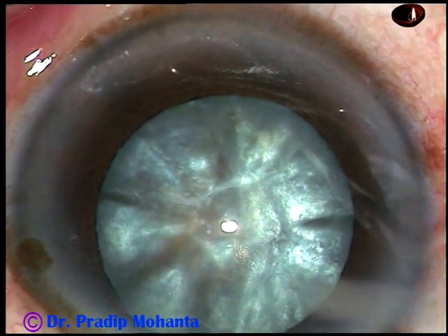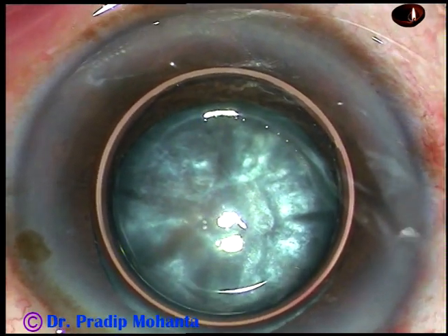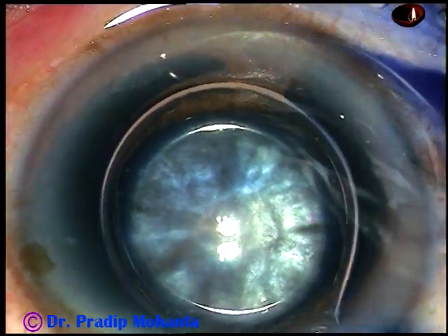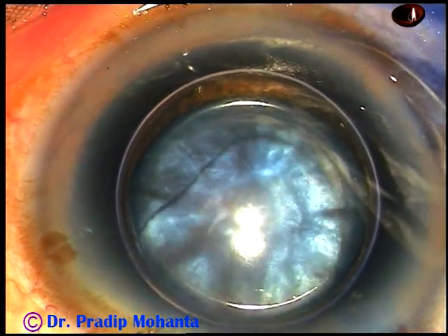In this case, I want to stain the anterior capsule of this cataractous lens with trypan blue dye under an air bubble. And here goes trypan blue 0.06% dye. The dye should touch all parts of the anterior capsule to get uniform staining.